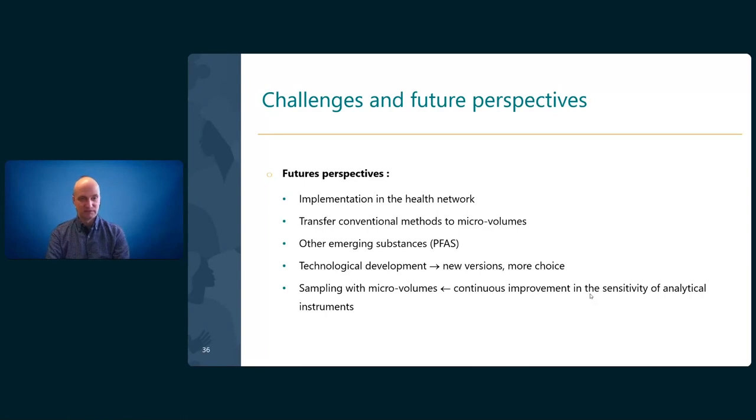So this is a future perspective on our side, to move from conventional volume to microvolumes. And we all know that there are other emerging substances which are showing high interest, like PFAS and others. So we work on that aspect, not only, as I already mentioned, developing and validating a method for isotope ratio of lead, but we are also targeting PFAS in whole blood.